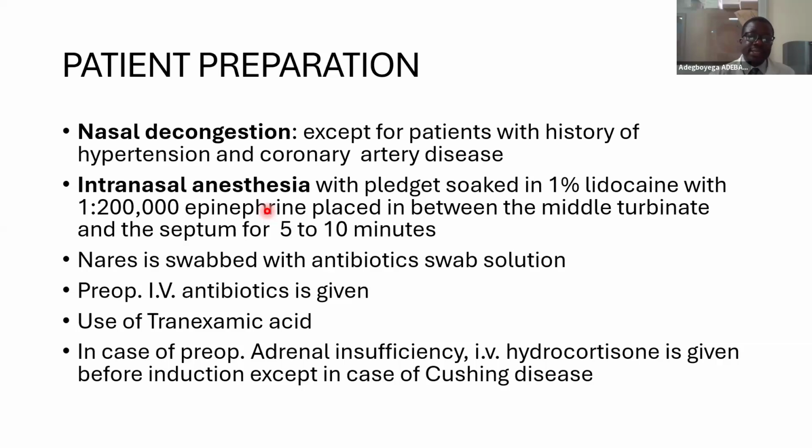Intranasal anesthesia can be done by use of pledgets soaked in 1% lidocaine and 1 in 200,000 epinephrine. Some people use 1 in 100,000 epinephrine, placed in between the middle turbinate and the nasal septum, just 5 to 10 minutes before the surgery. The nose is swabbed with an antibiotic-impregnated swab. The face and the nose are prepared with antibiotic-impregnated solutions, and also painted with iodine.